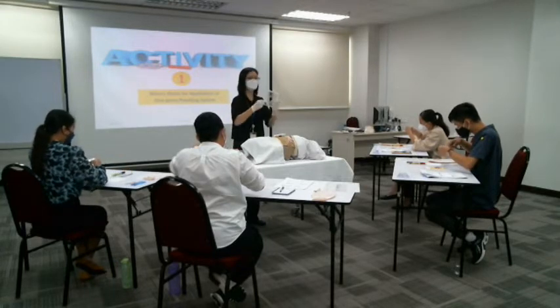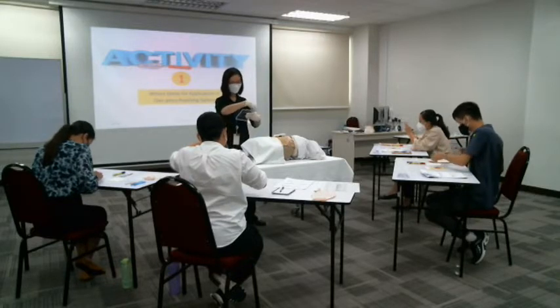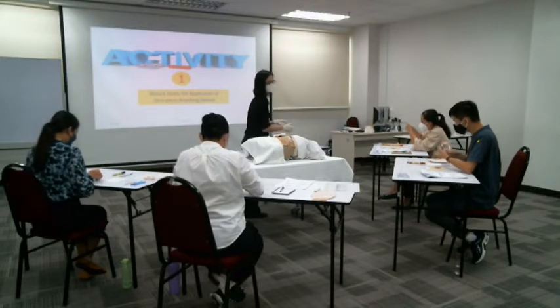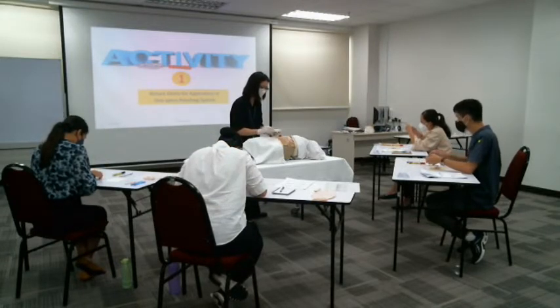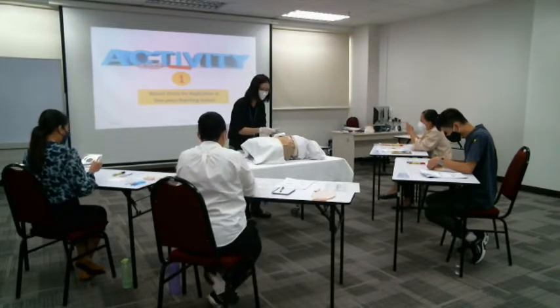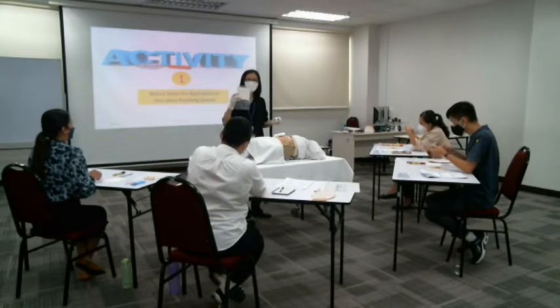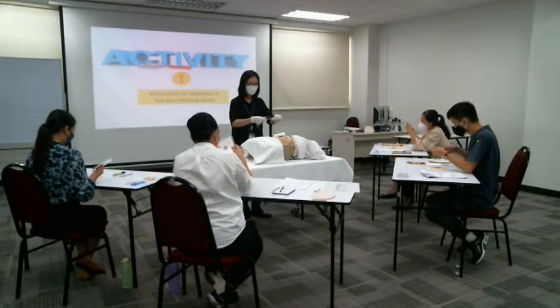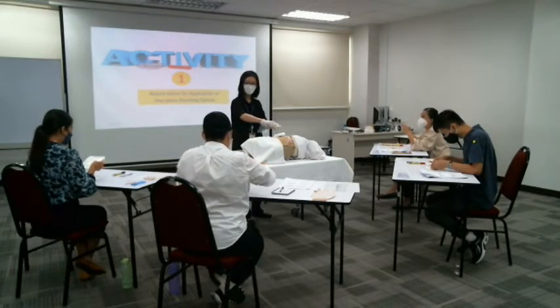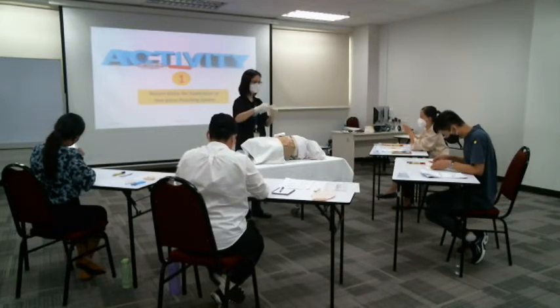Everybody is doing that. Good. Okay, cut and you check whether the size is okay or not. Trace it on the colostomy bag that you have. So remember, as I remove it from here this way, my colostomy bag is going to put on top of it. When you turn it over, the deck is supposed to be in the opposite way. Try on this first.